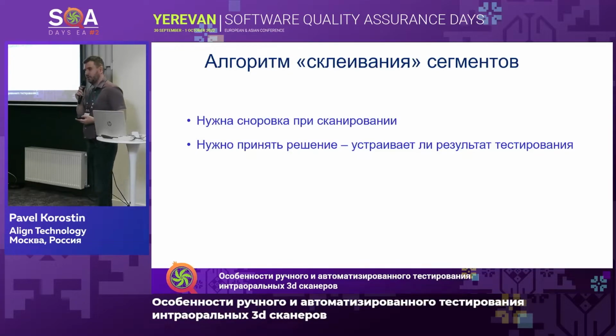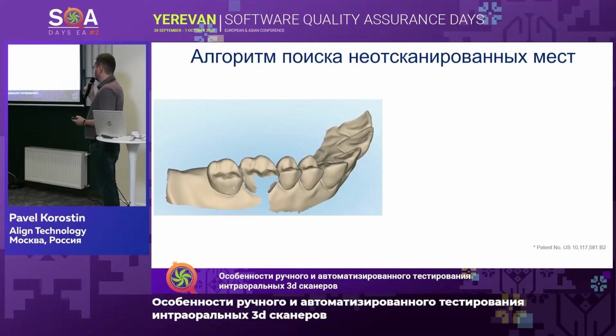Here you need to have skills, baggage, knowledge, good experience. When we have collected a long list of all our cases, you need to cast a critical look at it and make a conclusion about whether the algorithm works correctly or not, whether these overlap values are good for us, or we need to look at it again and revisit the algorithm, or maybe talk to the production team. That's what the QA specialist must decide.